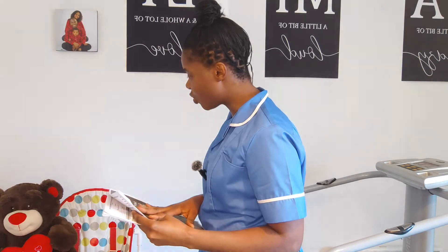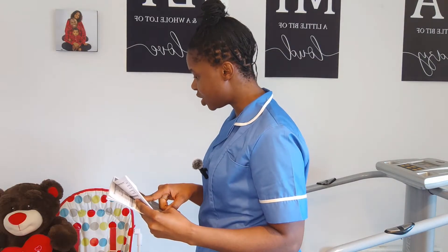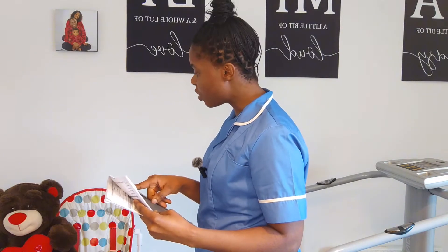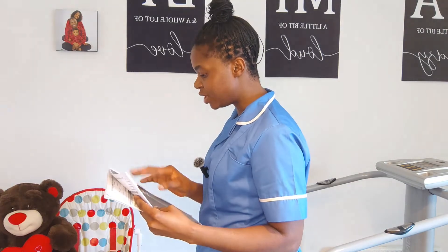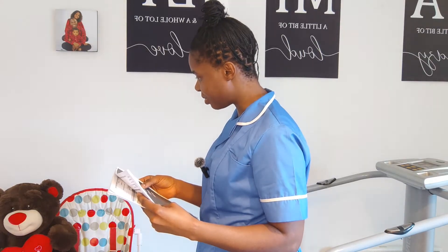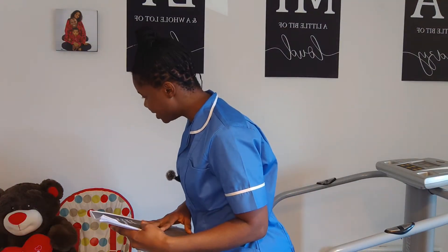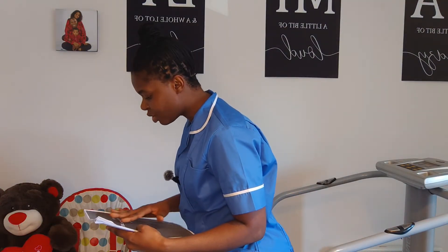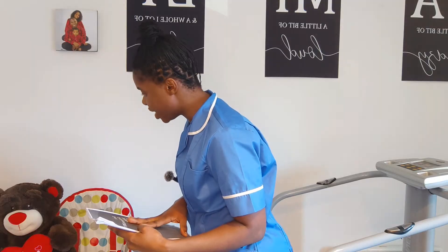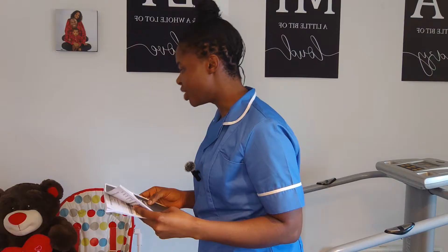I have here: Janet James, date of birth 01/01/1992, and your first line of address is 27 Dotting Grove, Badley Green — is that correct? So I have it properly documented. Are you allergic to anything at all? It's properly documented in my notes that you have no known allergies, so I can confirm I am with the right patient and I'm happy to proceed. How may I address you? Okay, Janet.